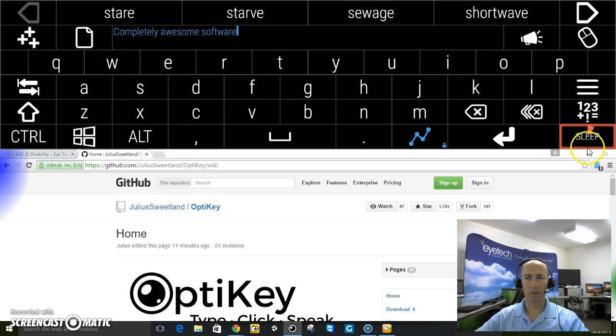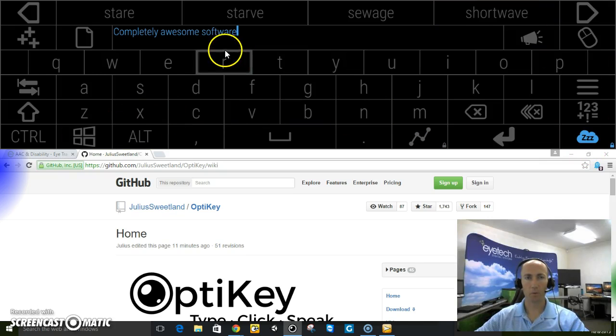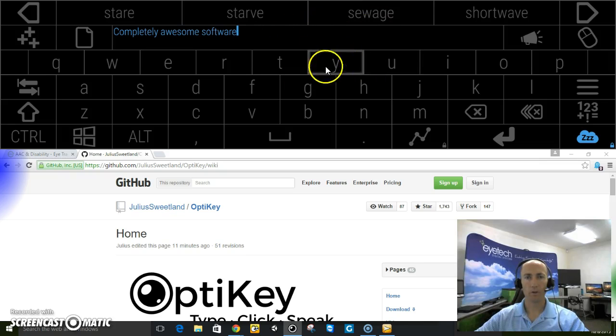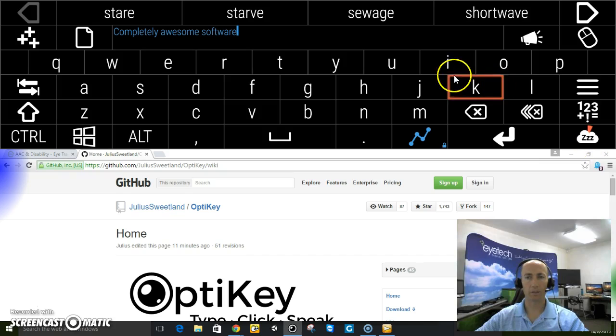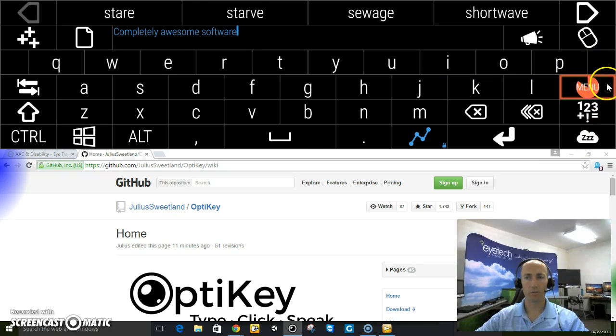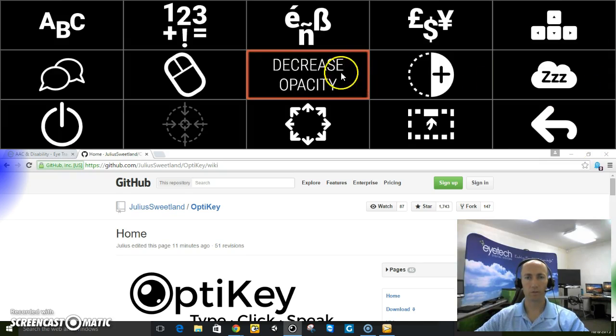Another nice thing is you can pause it. Say someone comes into the room, you don't have to worry about ever making a mistake. You can pause and unpause. And it also has a menu for other features.